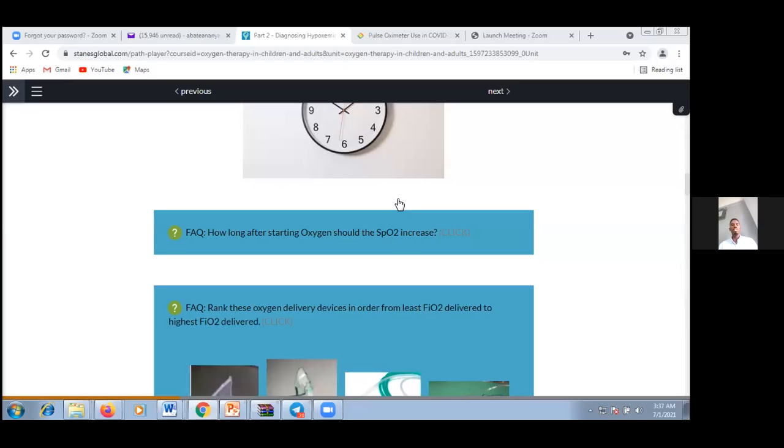So, large literature reviewed. In patients who have hypoxia during bag mask ventilation, there is a delay of about 23 seconds for a probe on the head and about 29 or more seconds in patients who have a finger probe. So the clinical implication of this result is whenever we are bagging a patient, if there is a decrement in oxygen, it doesn't mean that the saturation is really decreasing. So we have to correlate with our clinical judgment.